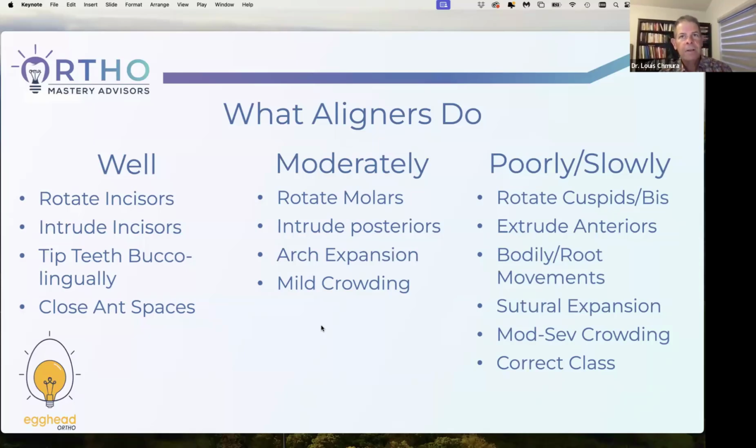Moderate to severe crowding, sometimes it depends on the other factors. And correcting class is forever when you use aligners. You have to do it 2 teeth at a time. You move the second molars back, then the first molars back. Then it takes forever. Whereas if you do it with some other things, they're done in 3 months with that part, and now you're just moving teeth. So it does depend on the proper mechanical setup, but this is a pretty good.